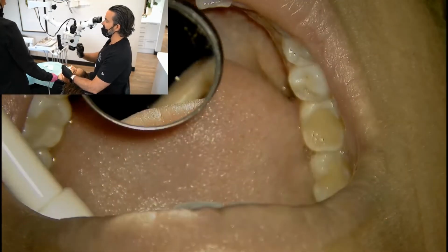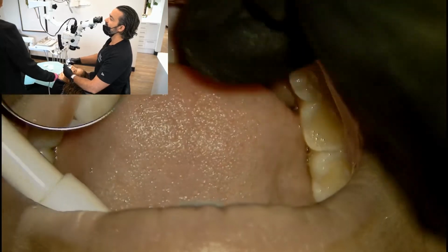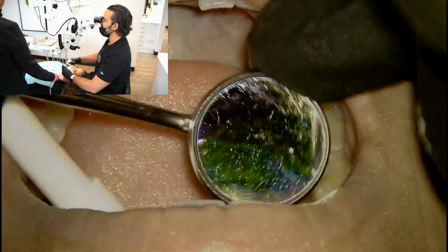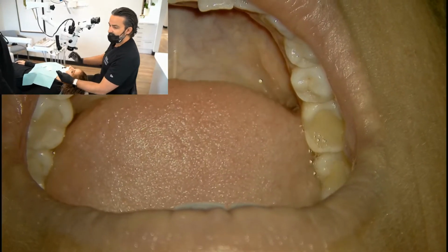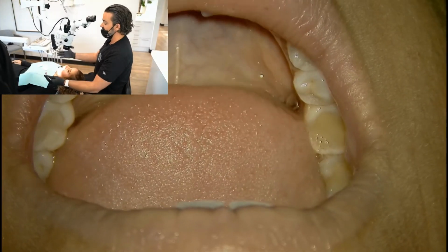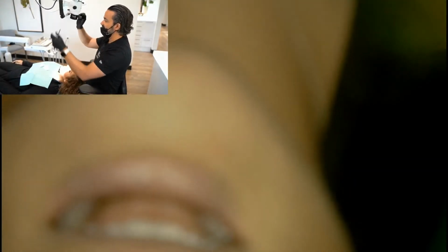Like I said, find focus first, and for the most part, this is like your 3 power loops that you're wearing, and very similar. In endodontics, we're looking for the little pinholes, and in general dentistry, you actually want depth of field and you want sort of position. If I go up farther, can you see this whole distance? If you look at my screen, I'll get this in focus.